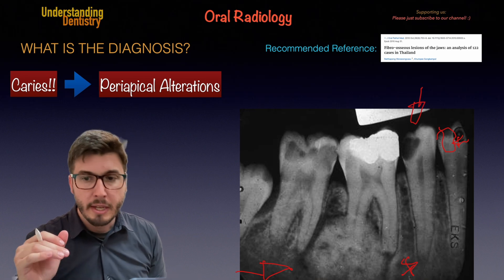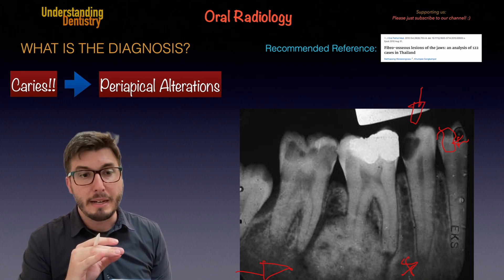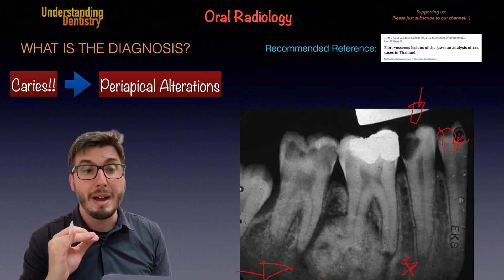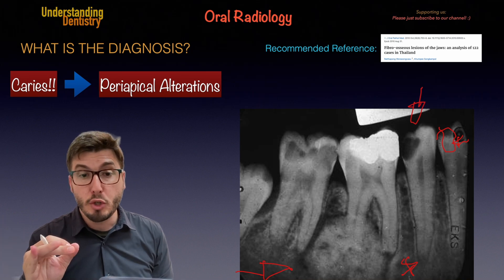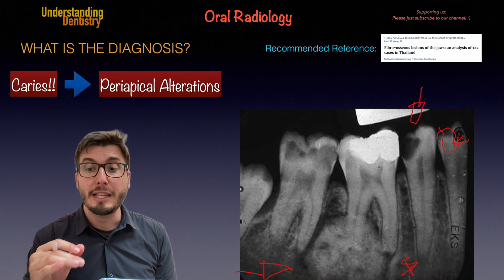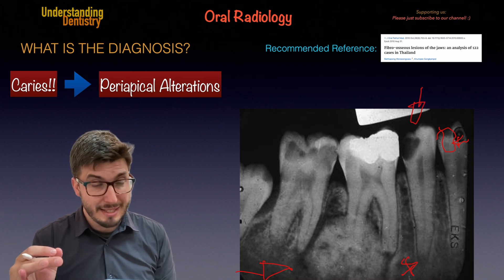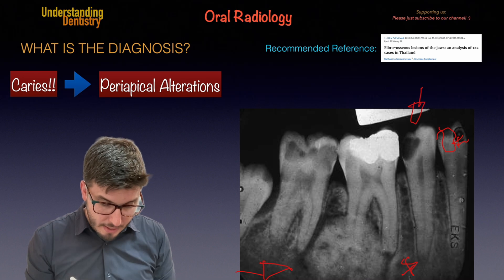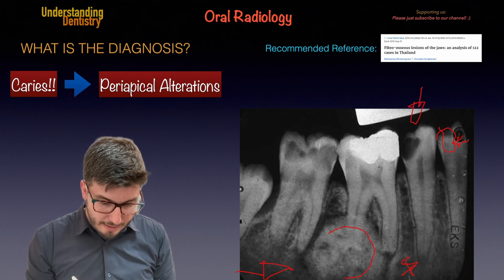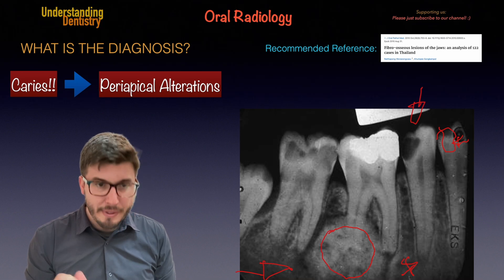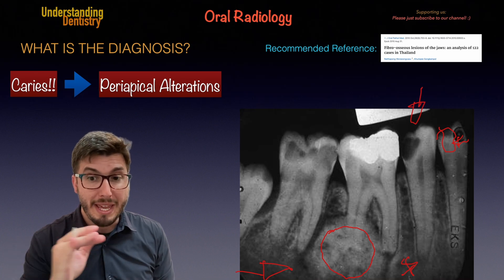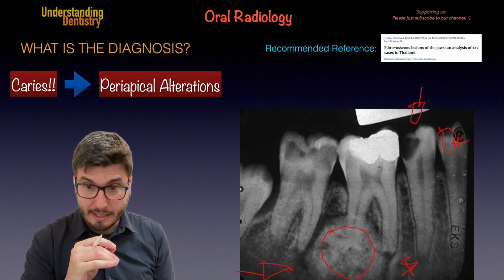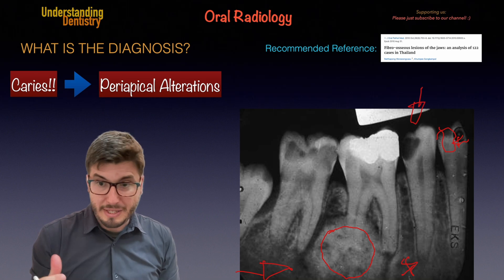So how to describe this lesion? We have a mixed lesion — it's well-limited, with a radiopaque lesion and a radiolucent halo. The lesion is heterogeneous in the sense that the radiopacity of the lesion is not the same. There are different levels of radiopaque densities here, because of the origin of this lesion.